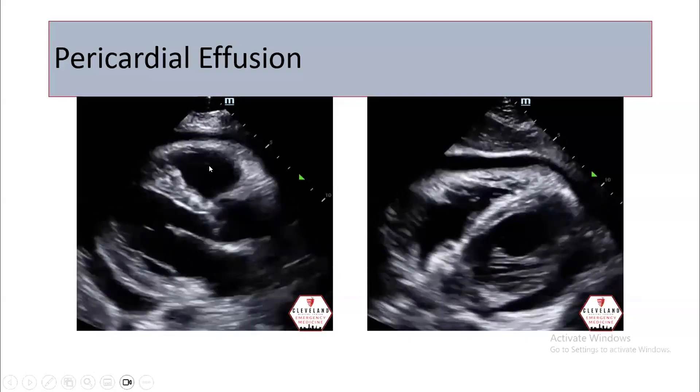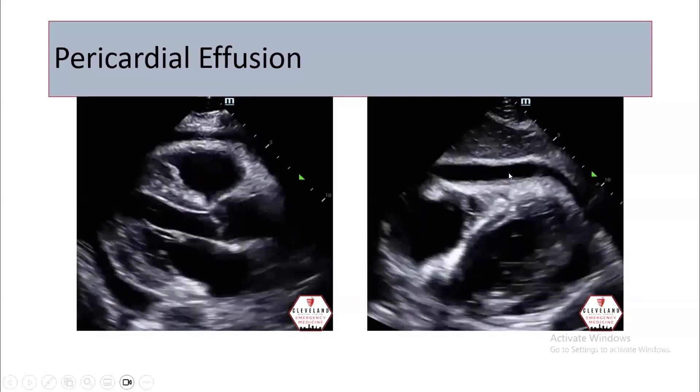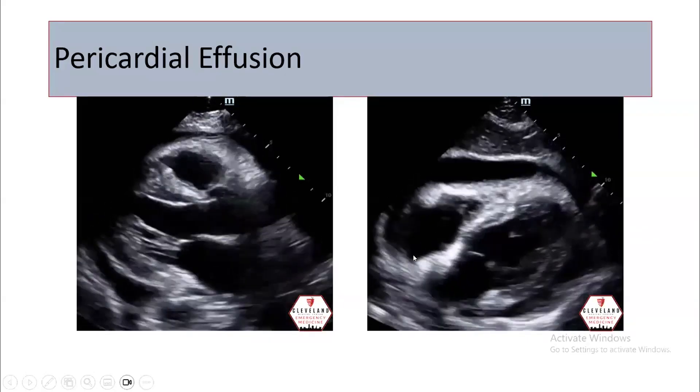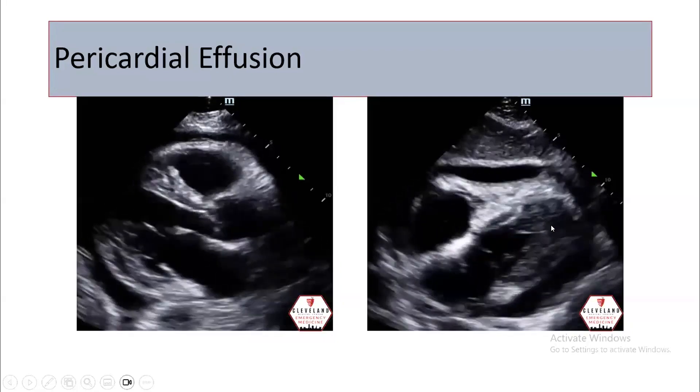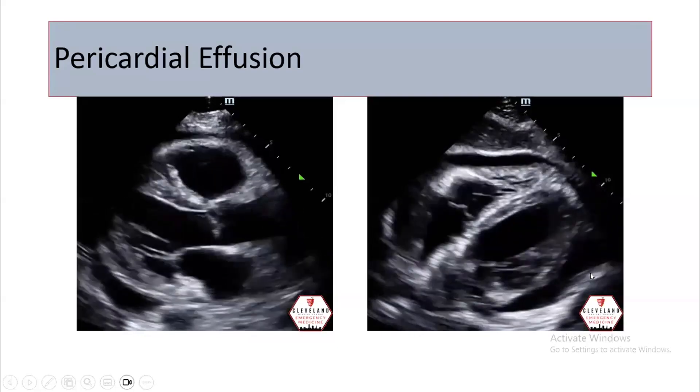Why not tamponade? Because it is not compressing the right ventricle. Here in the subcostal view, there is pericardial effusion. Do you think this is tamponade? Yes, because it is compressing the right ventricle — it compresses. And this is pericardial effusion from the subcostal view.